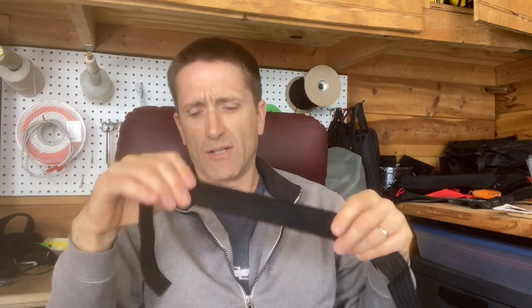So I tried this material here, about 1¼ inches. And I also tried 2-inch, and the 2-inch was a bit bulky. The 1¼, I think, would work just fine, but I wanted the product to be viewed as a tourniquet in the beginning. Today, I want it to be thought of as a multi-tool where people do direct pressure first, so a little bit different. But in any case, tourniquet people love 1.5 inches and above, and I knew that 1.25 would get rejected, even though you can wrap one next to the other, it would be rejected just for that. So today's wrap is 1.6 inches.